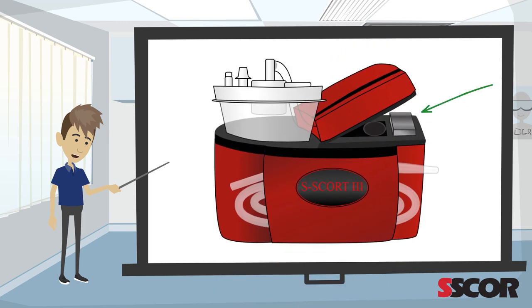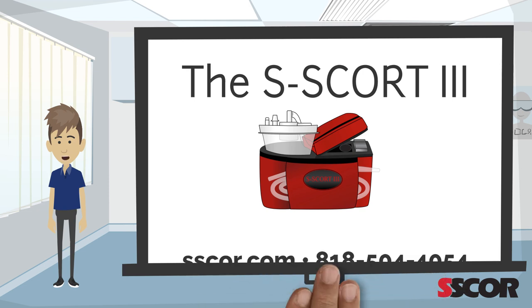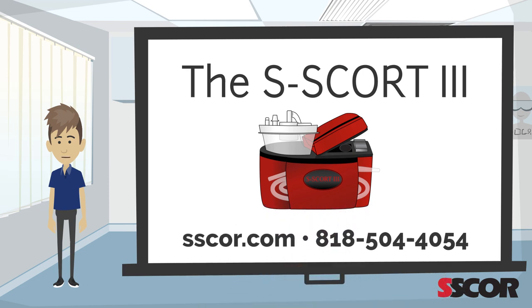The battery is easy to change. Simply unzip the top cover and pull the battery out and replace it. The Escort 3 weighs only 7 pounds and will operate from 30 to 45 minutes on a full charge.